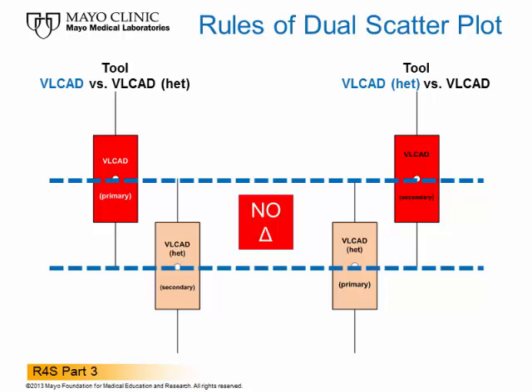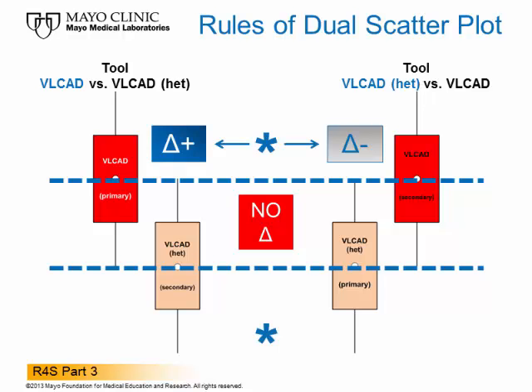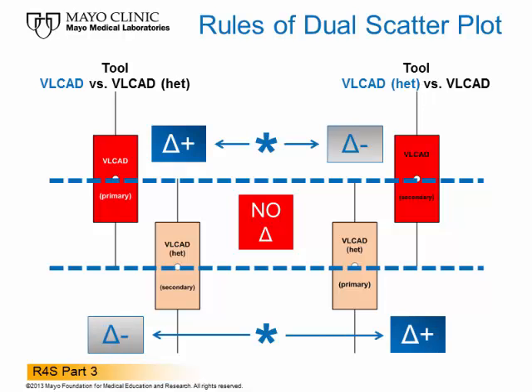A result above the overlap range increases the score of the tool on the left and has the opposite effect on the tool on the right. A result below the overlap range reverses the impact on the two sides. So, a completely normal C14:1 to C12:1 ratio is actually very informative to achieve the desired differential diagnosis, even if the same result would not trigger any score in a one-condition tool for either condition.